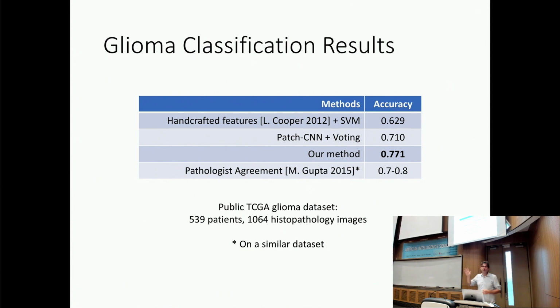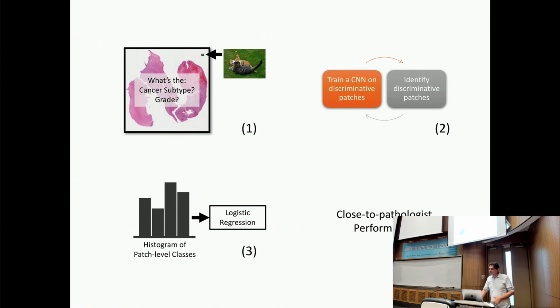What is more interesting, though, is that in a similar study, not with the same images, okay, but in a similar study for this cancer, they asked 4 pathologists to read the slides, and then they measured whether the pathologists agreed. Okay, that highly trained doctors, they had approximately the same level of agreement. Okay, so what does that mean? That the labels that we were given by the doctors were only about 80% sure that this is what it is, because they cannot agree within themselves. Okay?